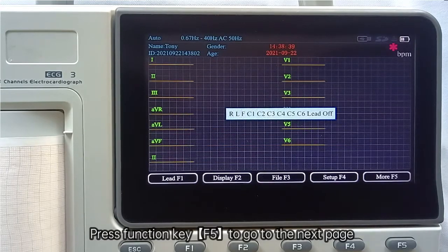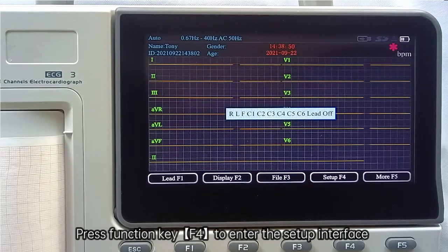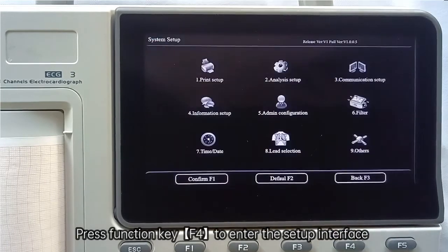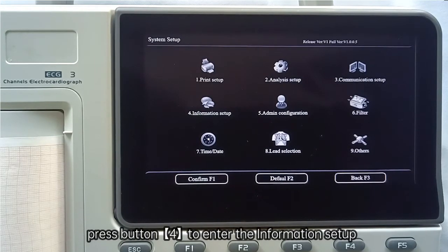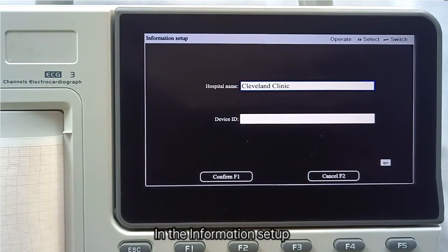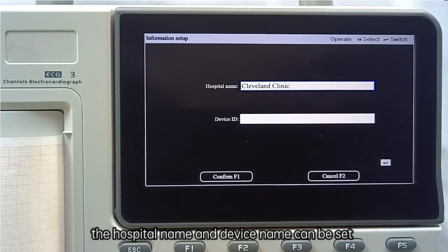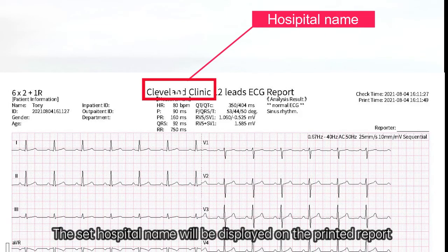Press function key F5 to go to the next page, which includes lead, display, filter, and setup options. Press function key F4 to enter the setup interface. In the setup interface, press button 4 to enter the information setup, where the hospital name and device name can be set. The hospital name will be displayed on the printed report.